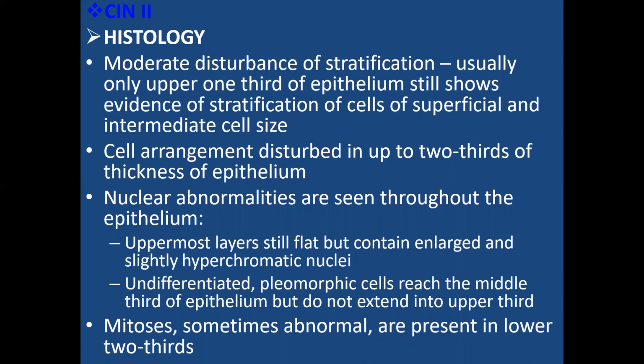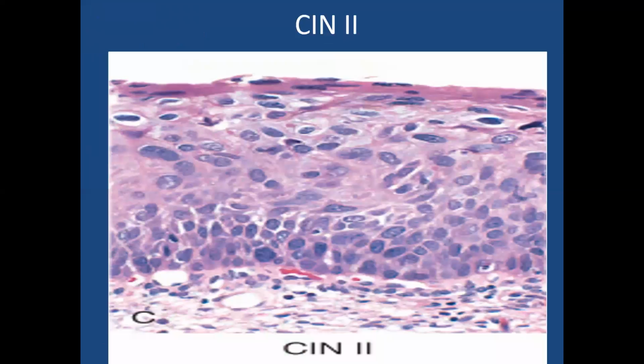So for CIN2, just like we said, I'll go straight to the image. This is better. The undifferentiated neoplastic cells now increase their area. The first was 1/3, but now they move all the way beyond the 1/3 up to 2/3. So differentiation starts from somewhere around here to the top. Unfortunately, several nuclei here are not showing very well, so it creates the impression that this is some cytoplasm. But from here, it looks like it stops. Here you see some small differentiation to the top.